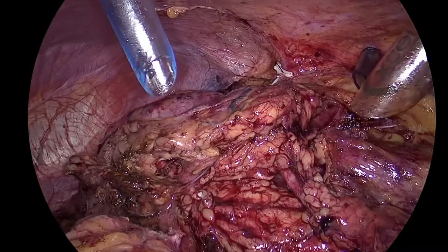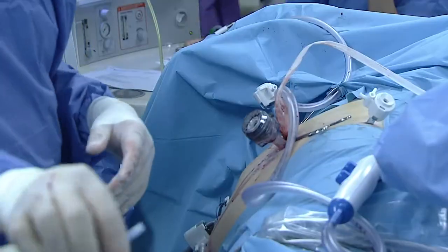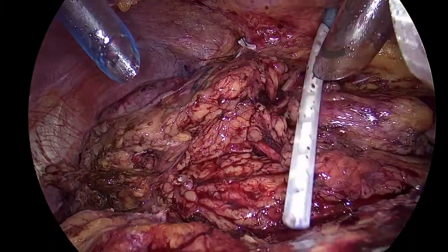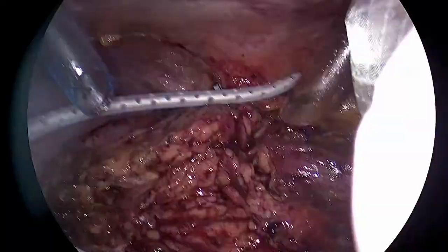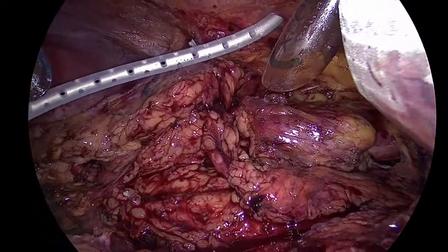This bending of the ureter there, once the belly will drop, it will straighten up. Okay, give it to me. I always put a drain inside. I know many people do not. Also radical nephrectomy? Always, just for a couple of hours. I know that a lot of people don't.